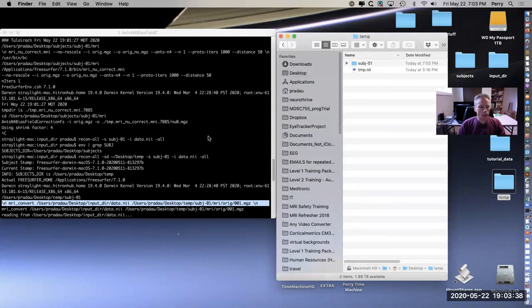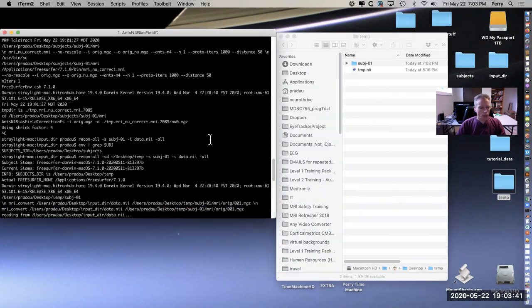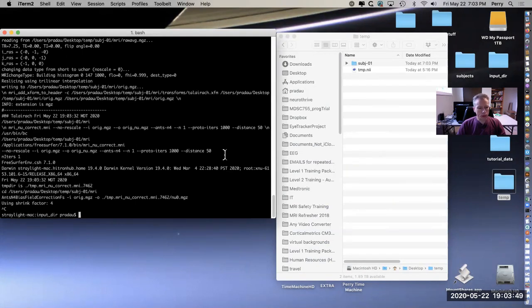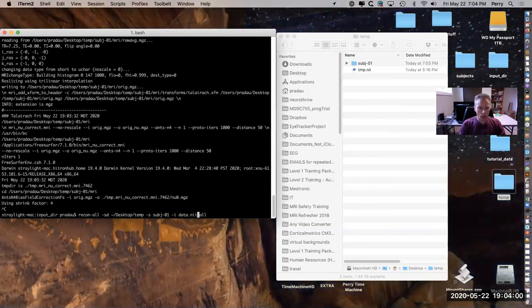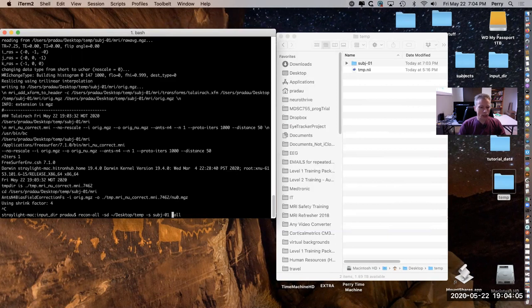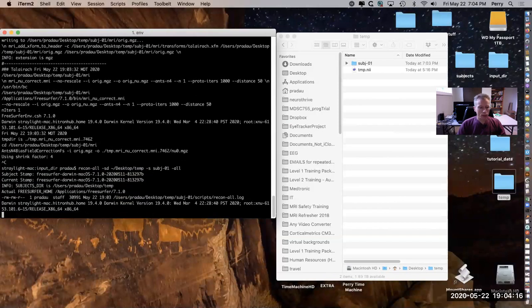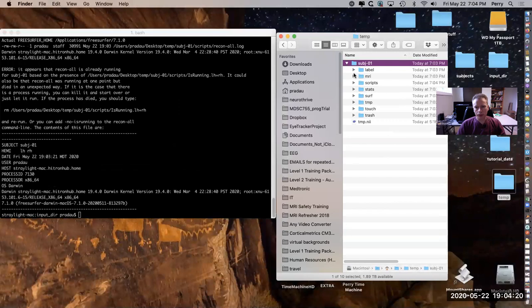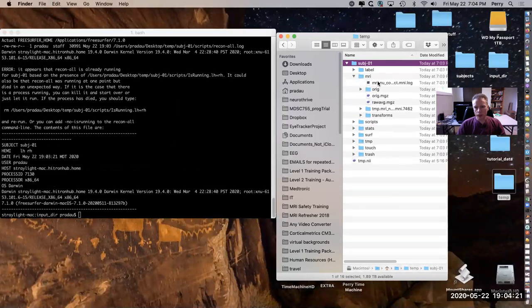Now let's suppose that for some reason there is an error and you've figured out how to fix the error and you come back and you want to run this again. What you should do is drop this dash i and run it again, and that way it will not cause an error - it will just realize that you're using this directory in the subject directory. In other words, because this exists and it has the mgz already created in here, then you don't need to specify dash i.